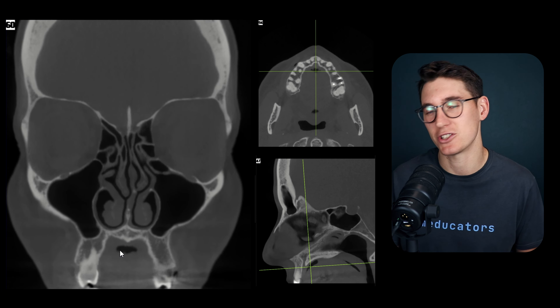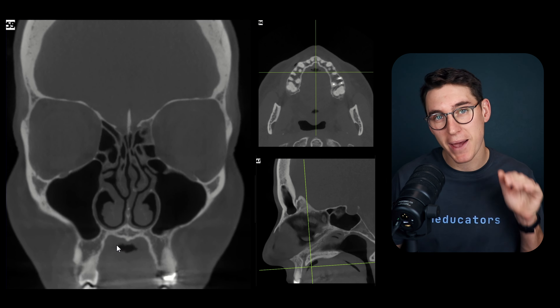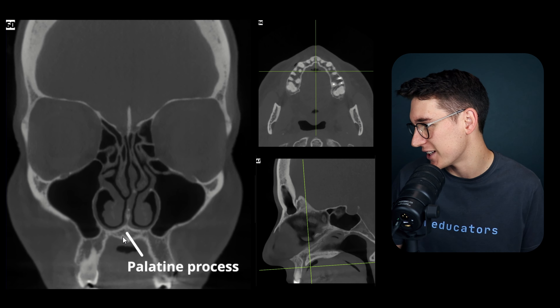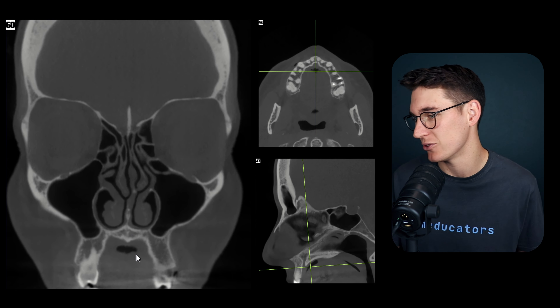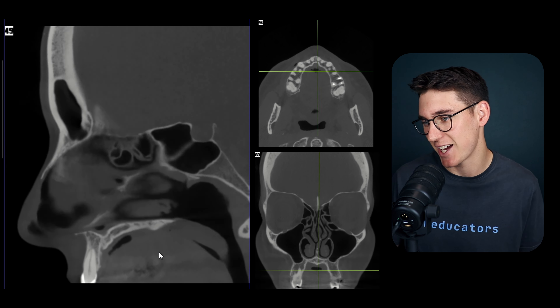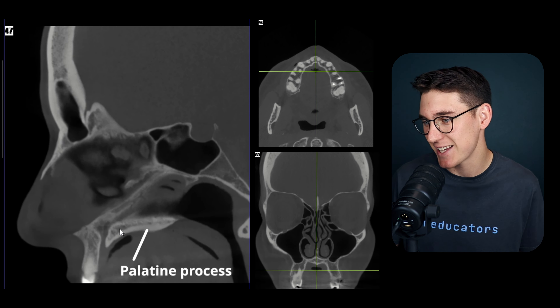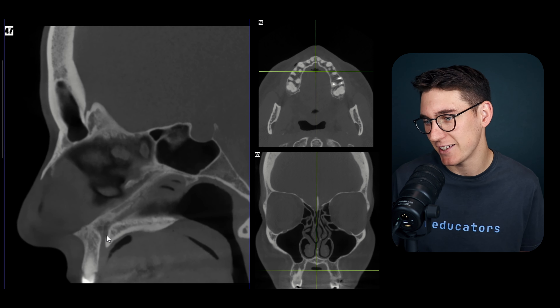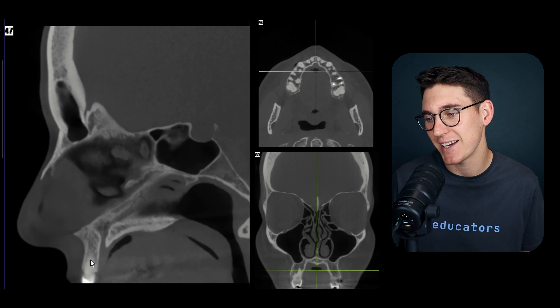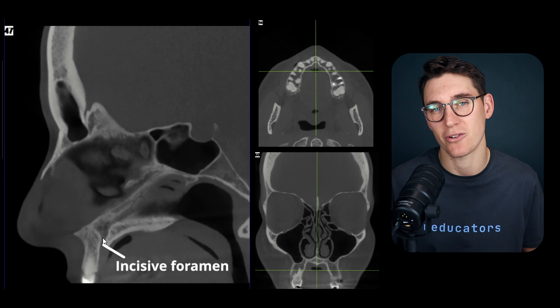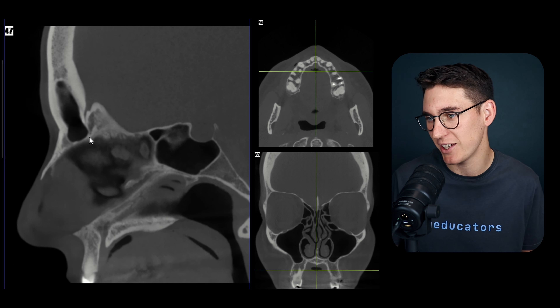The last process to examine is the palatine process, which extends posteriorly. Visible on the coronal scan lying horizontally, it's best seen on the sagittal scan where it extends out posteriorly. At the midline, there's a foramen running just behind the incisors - this is the incisive foramen.